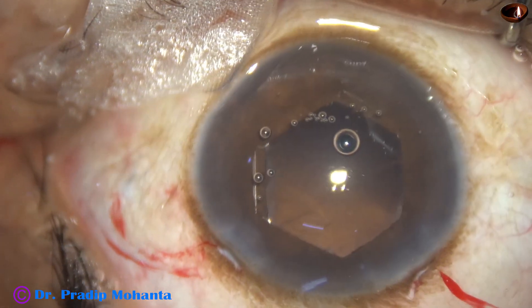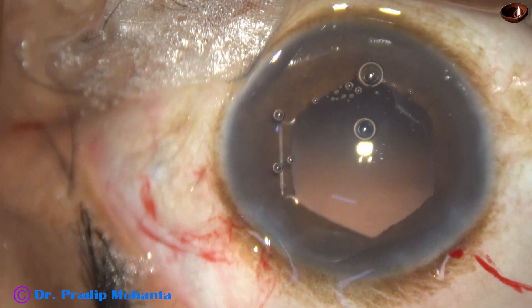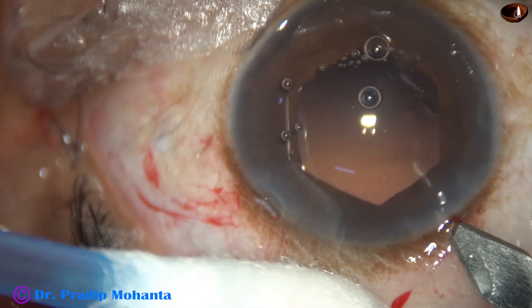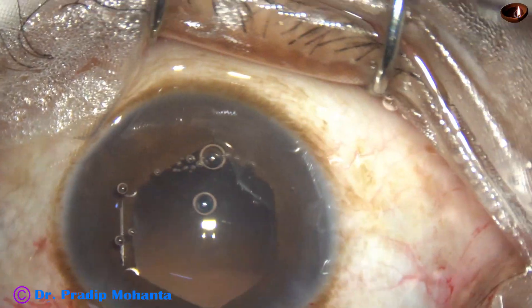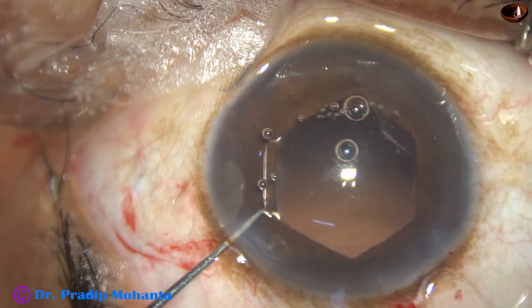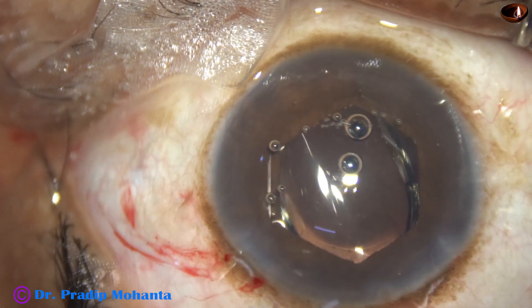In cases where the B-hex ring is in place, we must enlarge the main wound and the tip of the cartridge should go beyond the part of the B-hex ring which is just in front of the main wound. So I am enlarging the main wound slightly, and now the cartridge with the intraocular lens is advanced. The leading haptic goes in and the trailing haptic also goes into the capsular bag.